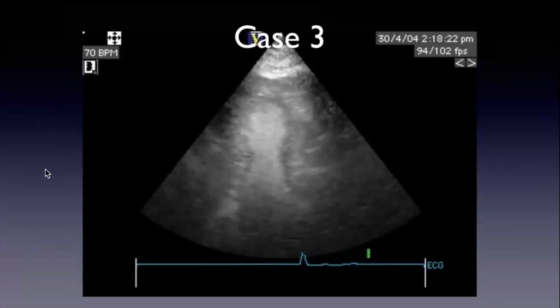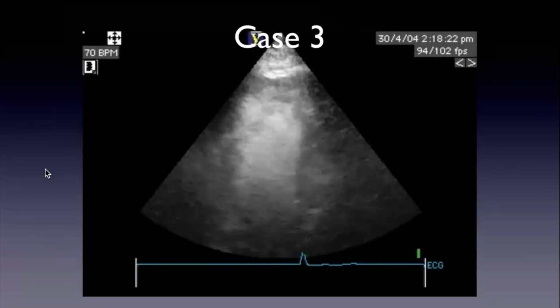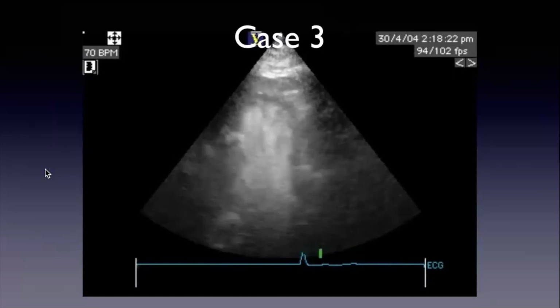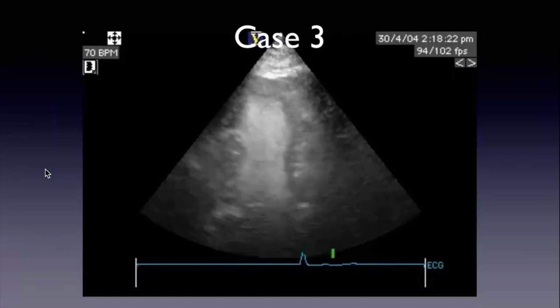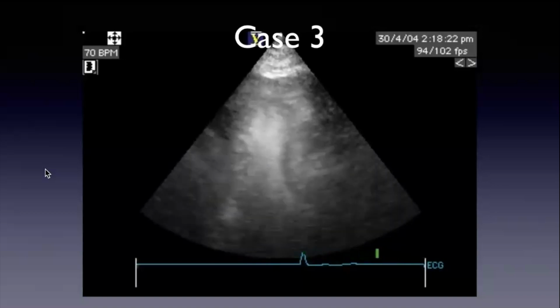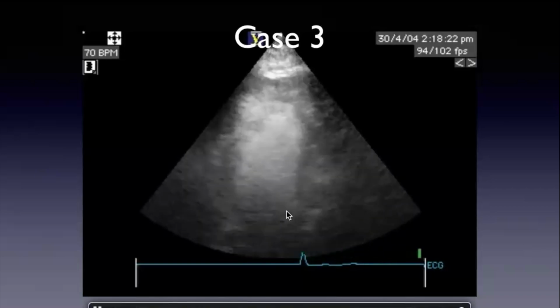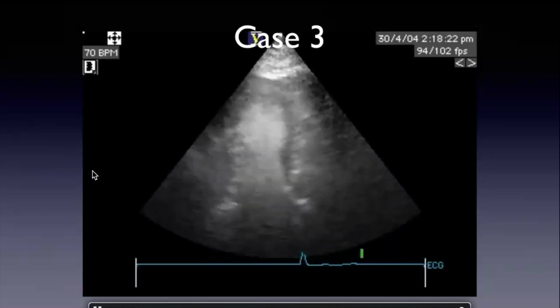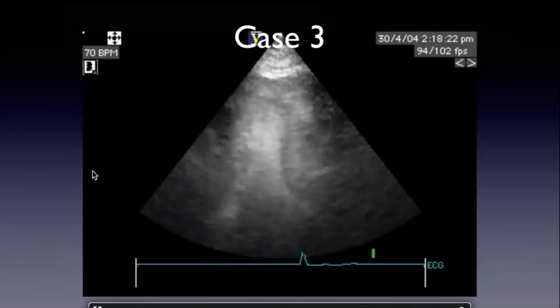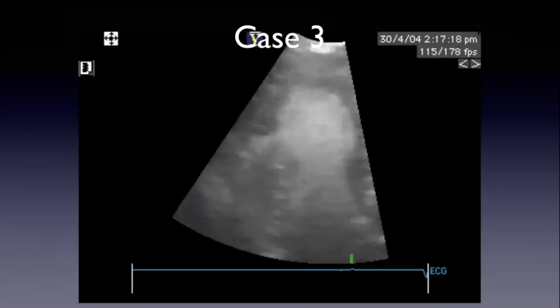You can see if you're an expert contrast user when you can tell the view without any of the labels. Just from experience, a sonographer and echocardiographer can tell based on the shape of the ventricle whether or not it's a 4, 2, right? Am I right? There's a 3. Yeah, you can see a little bit of the LVOT over here. But still, better put the label on. No, I don't need labels. The label is free. Use them wisely. Okay, and then really a zoom view here.